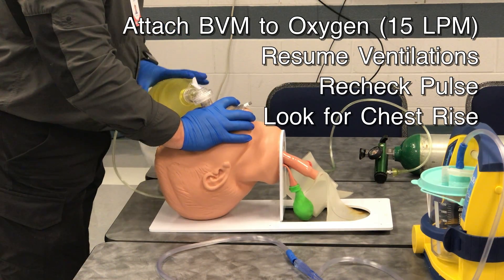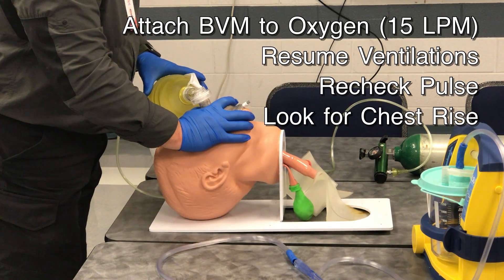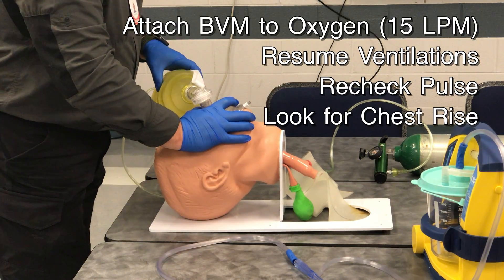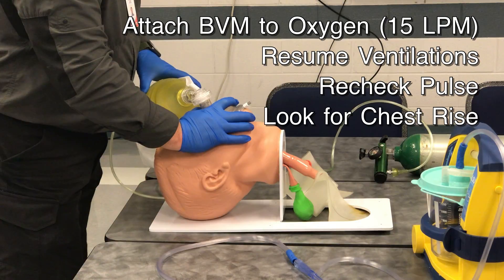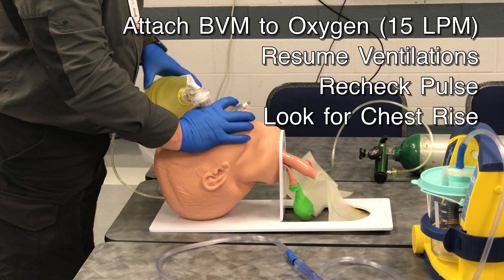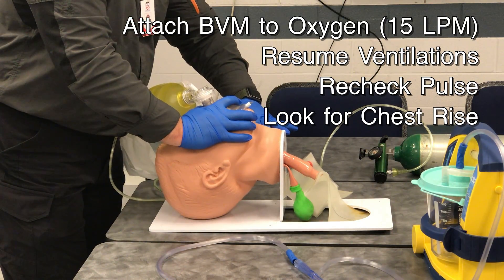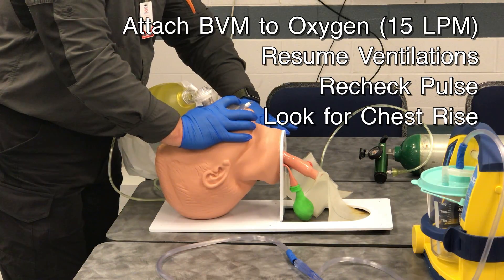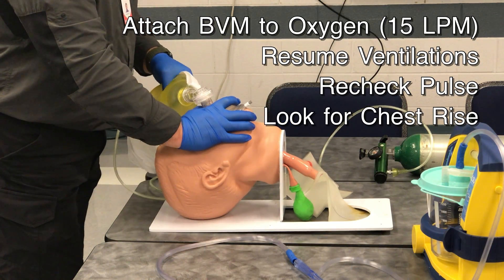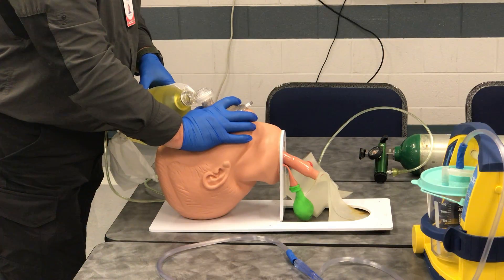One — 1, 1,000, 2, 1,000, 3, 1,000, 4, 1,000, 5, 1,000. I will recheck the pulse to make sure I have a carotid pulse. I still have a carotid pulse and I will continue to ventilate at one breath every five to six seconds.